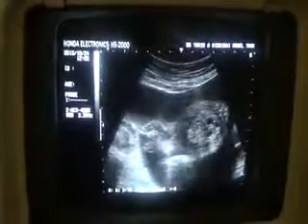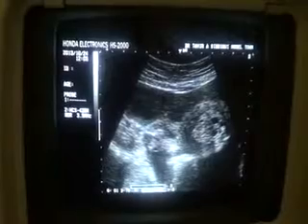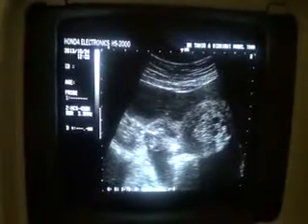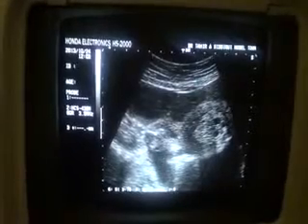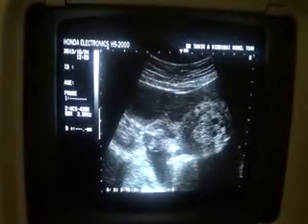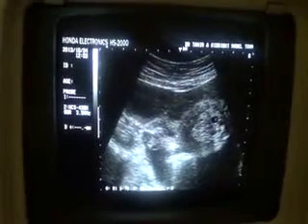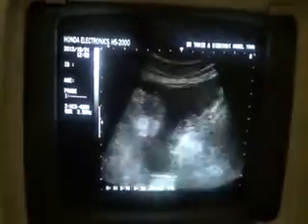This is the other round ligament. This is the ovary. This is the round ligament. The right ovary is seen with fluid. This is all fluid. This is the uterus. This is the mass I am talking about, and these are the tiny cystic areas within it.